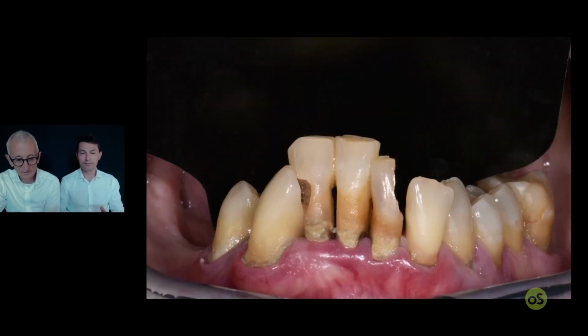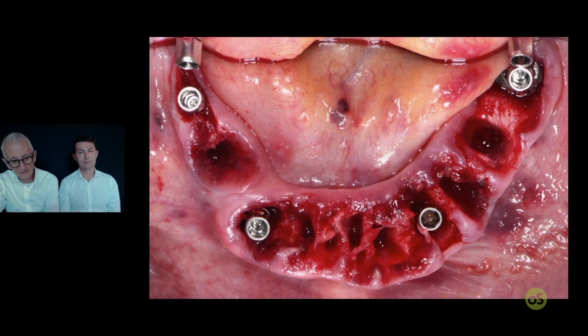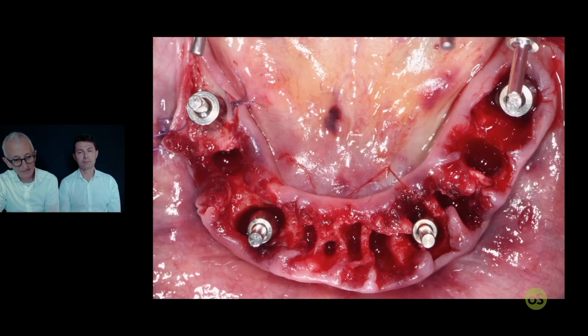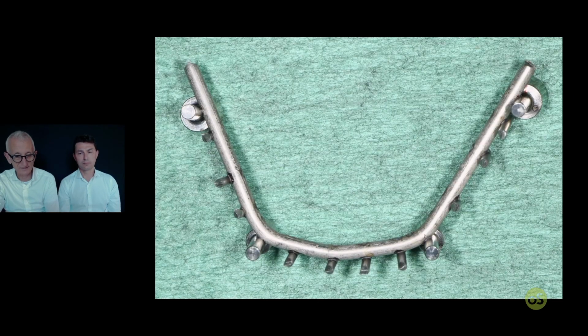So, you extract the teeth, try the shell, and see if everything is okay. Then put some implants in the established position, make a quick impression with some bite registration material to figure out where the position of the abutments is compared to the tooth anatomy, select the appropriate conometric abutment and coping, and finally connect them with a piece of wire.